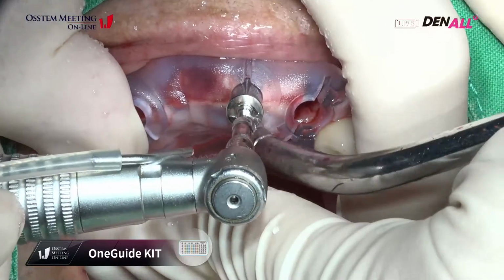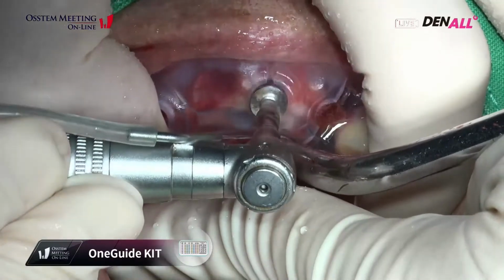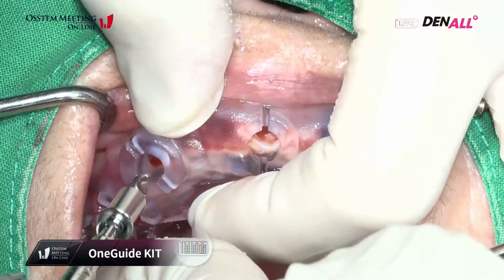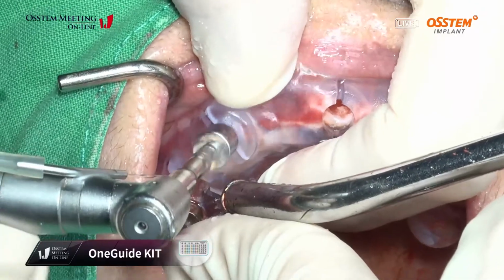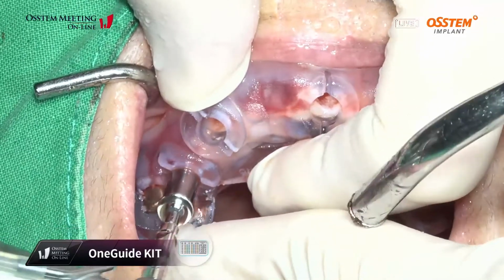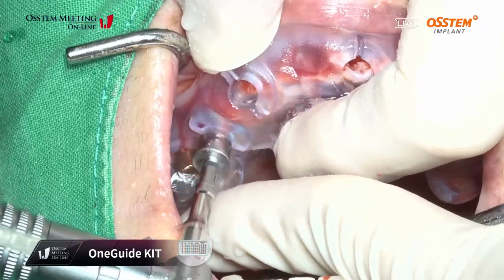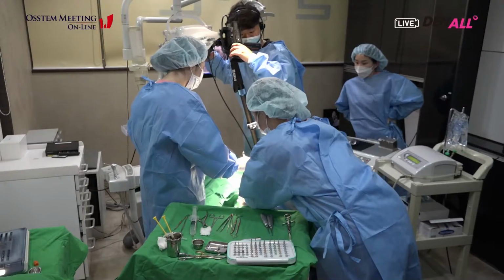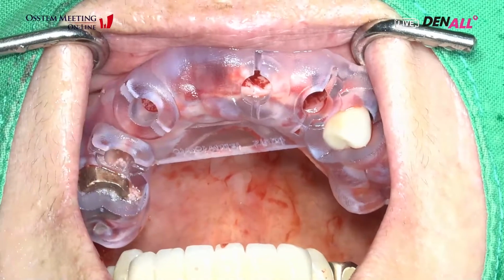And then right canine area. Second premolar. Here, both canine and central incisor area, I will place 3.5 by 10.